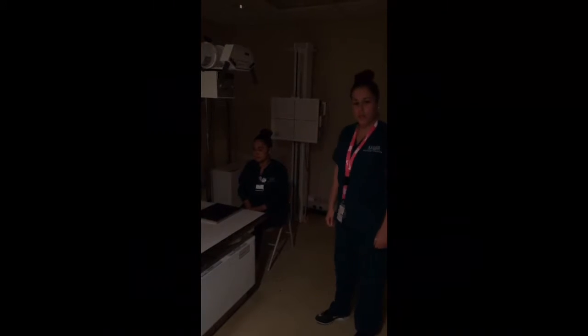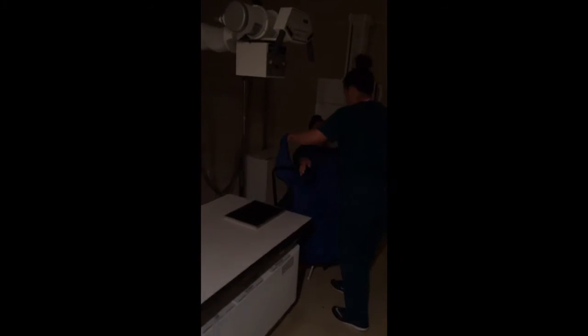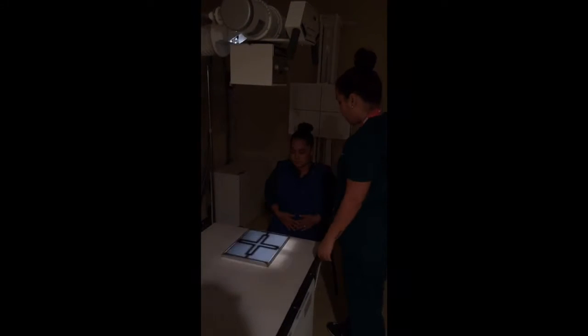We're going to start off with the first 3 exams, and I have my patient here, and before we begin, we're going to go ahead and shield her. Is there any possibility that you might be pregnant today? No? Alright, perfect. And we're going to go ahead and take an x-ray of your wrist.